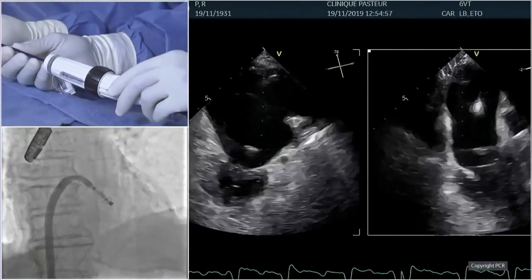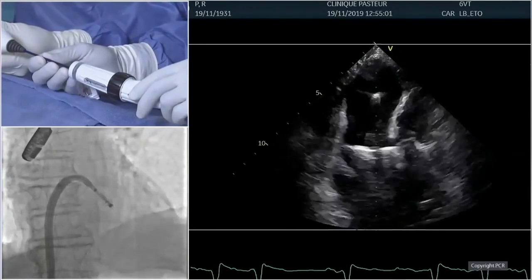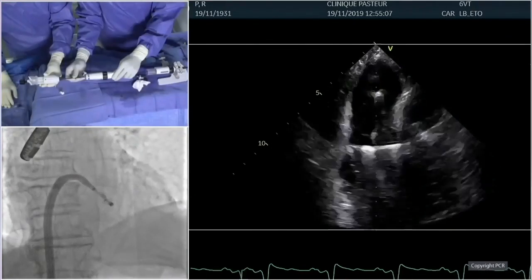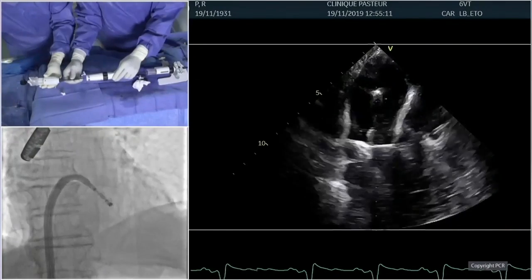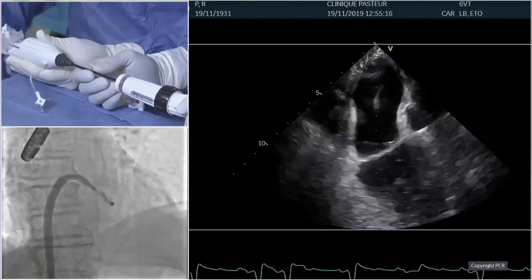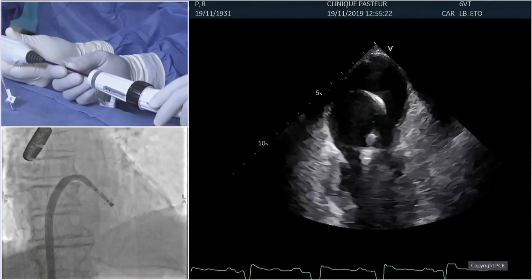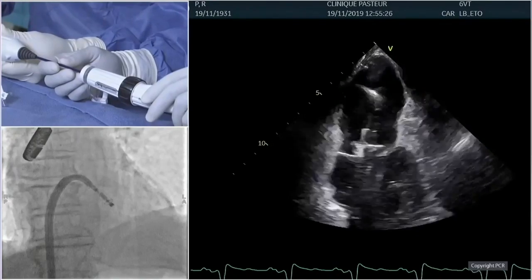Okay, Didier, so I follow you. As you go forward, are you closing the device or are you just leaving it? A little, yeah. I've closed a little bit. I was in a capture-ready position with the Clasp with the paddles totally horizontal, but you see its anatomy is quite small. So I slightly closed the paddles a little bit to get a different angle, but really slightly.